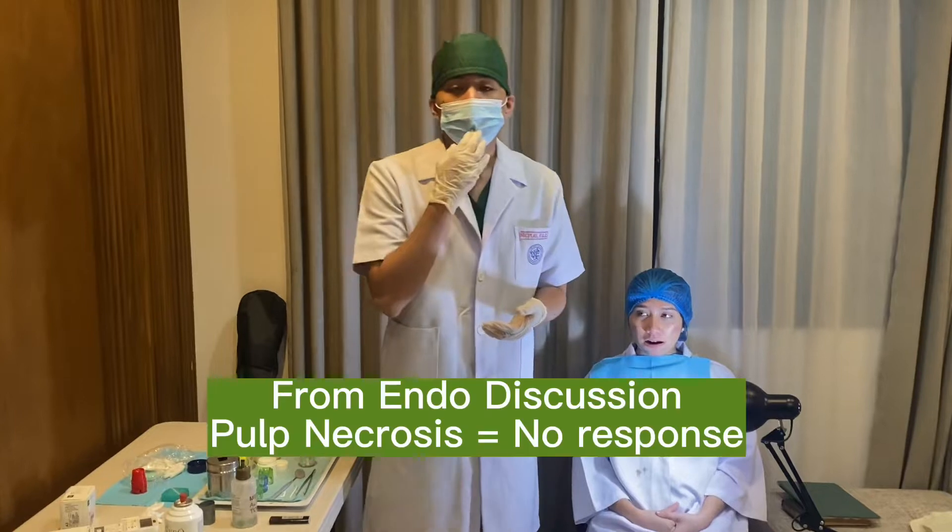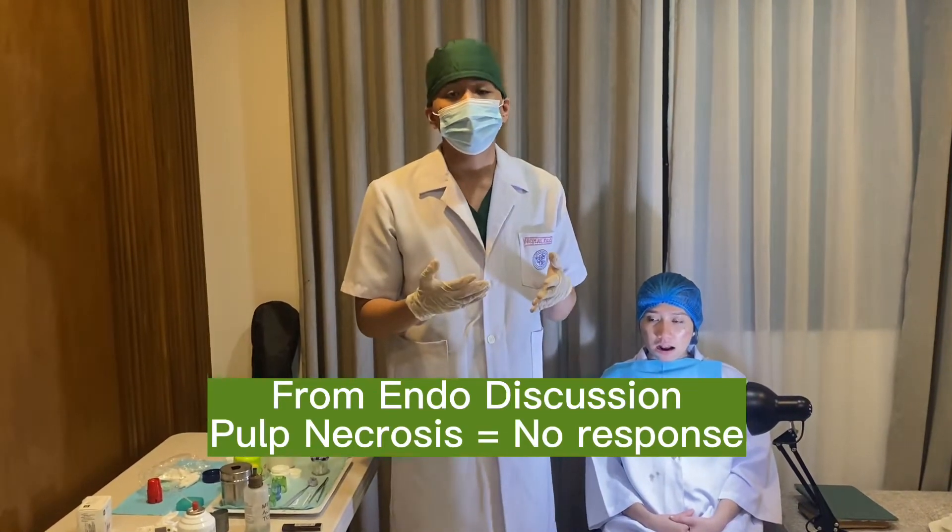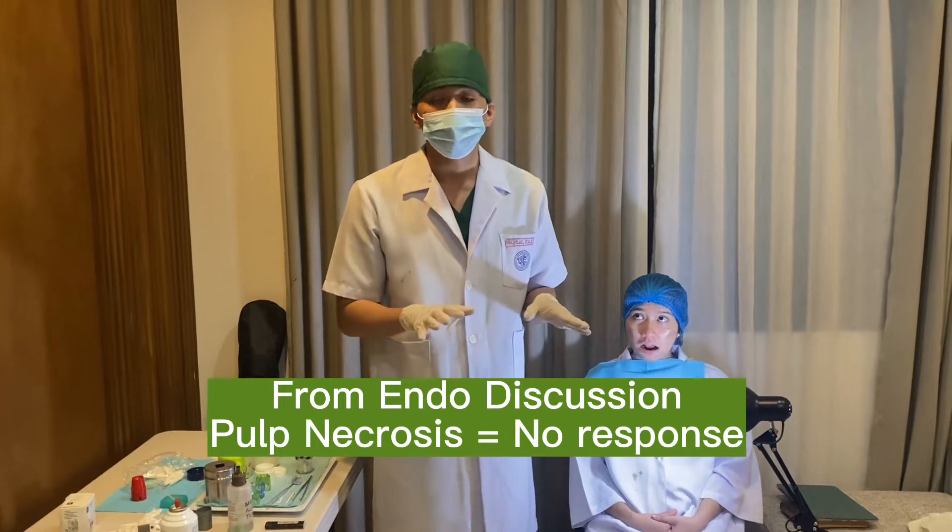But for my patient, the pulp of the tooth is in necrosis already — it means it's already dead. So the patient shouldn't be responding to any of the cold or heat tests.